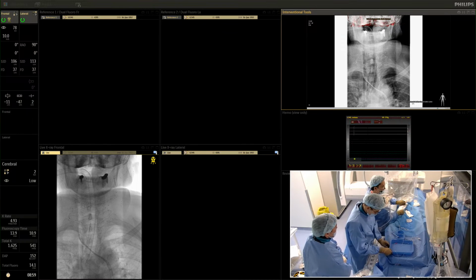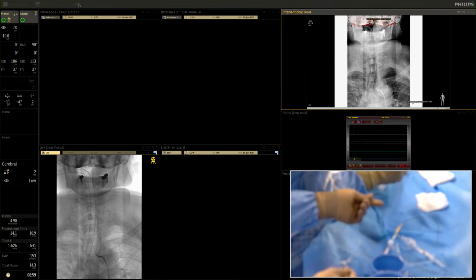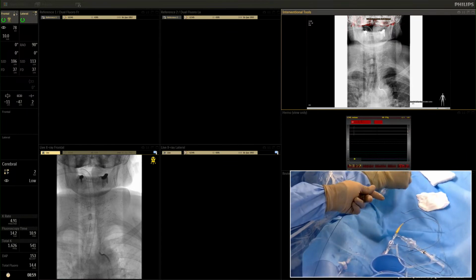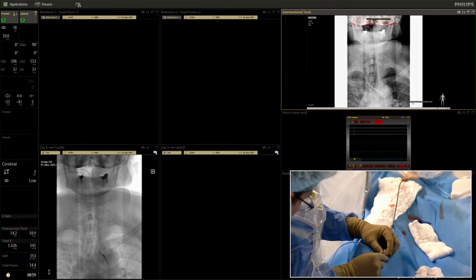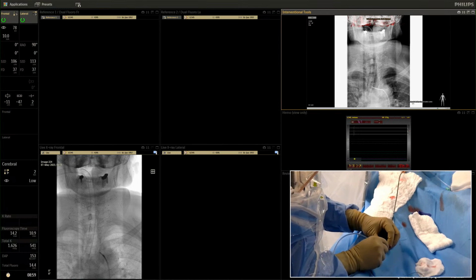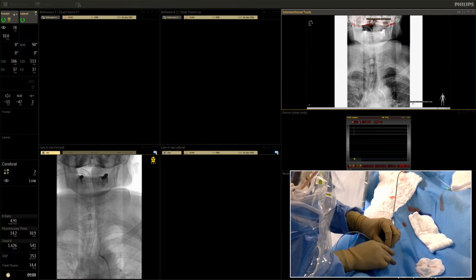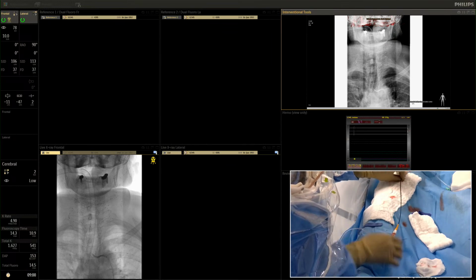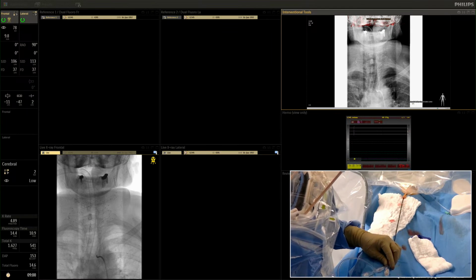Okay. I asked for the wire to switch for the left side, and I will control the left side, and then we will finish. And usually, if it's necessary, we can place a stent and straighten the kinking. Yes, I see. Today there is no indication, but if the patient has any TIA symptoms, it's possible to stent this kinking.